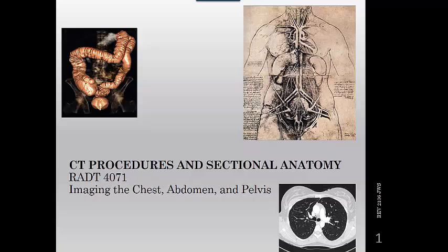The demarcation of the esophagus and the GE junction can be improved by giving the patient thin CT barium shortly before the scan, but it's usually not necessary. I don't remember ever doing that for a chest CT. If we're looking at the GE junction, most of the time you're going to do a CT abdomen pelvis for that. But I guess it's something you can do to mark the GE junction.